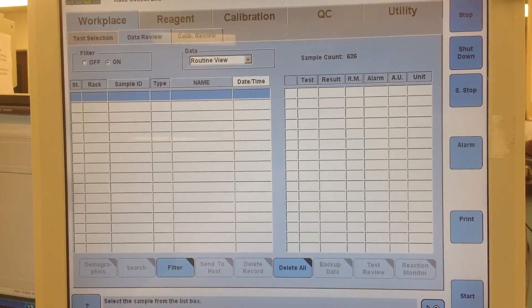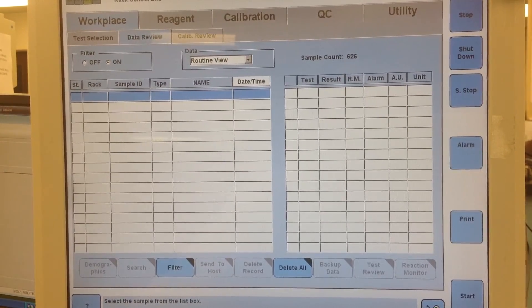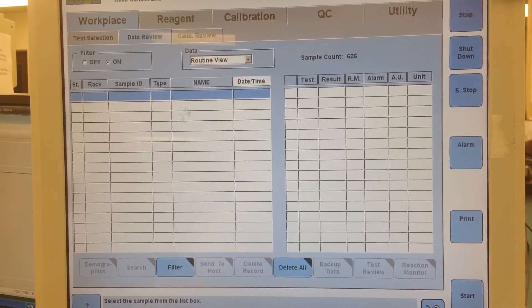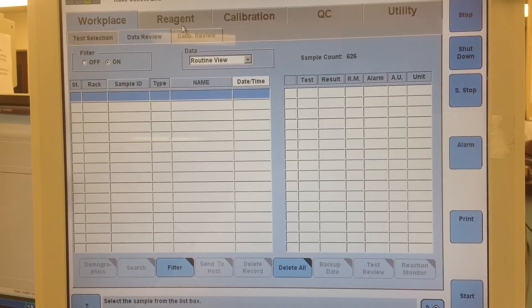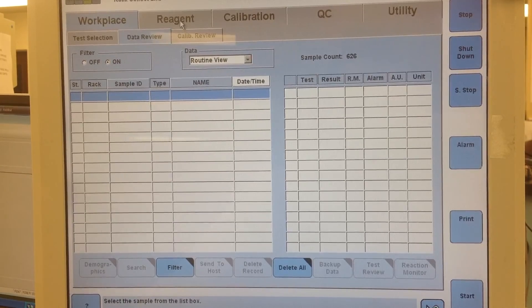Alright, so real quick I wanted to go ahead and make a video about what I do to determine what reagents I need to put on.